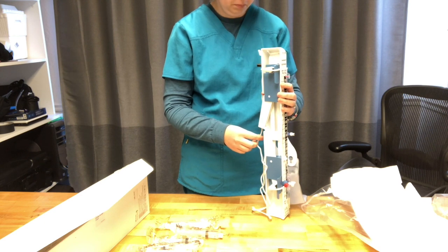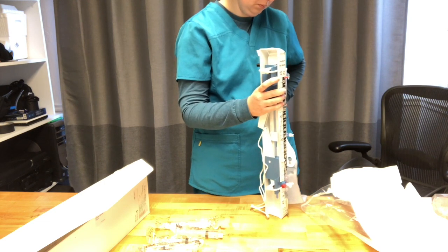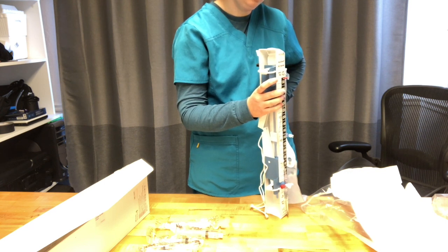The AccuDrain system works on the principles of gravity with zeroing to an external landmark. Ensuring the AccuDrain is properly secure may prevent the drain from falling below the external landmark and resulting in excessive CSF removal from the patient. For simulation reasons, the pole will not be pictured here. With nothing else placed on the pole with the drainage system, this allows for free upward and downward movement of the AccuDrain to accommodate when the patient repositions.